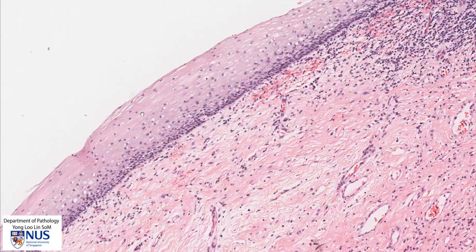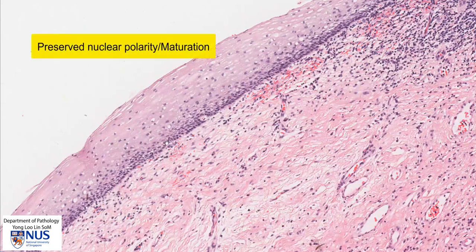As the epithelium moves towards the superficial layers, the nuclei become more flattened, and the NC ratios are a lot lower because there's a lot more cytoplasm. So we have high NC ratios in the basal layers normally and low NC ratios in the superficial layers. This kind of gradation in appearance is known as nuclear polarity, and there is preserved nuclear polarity here.